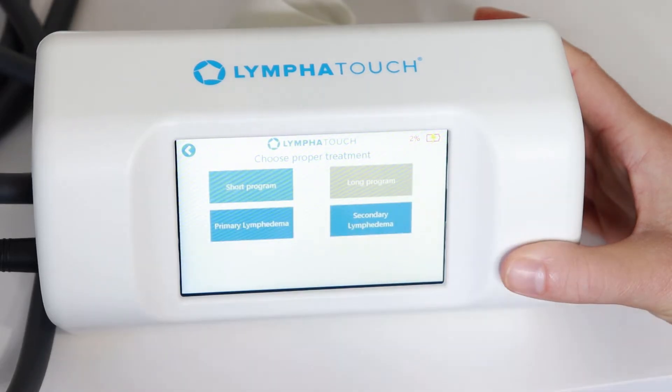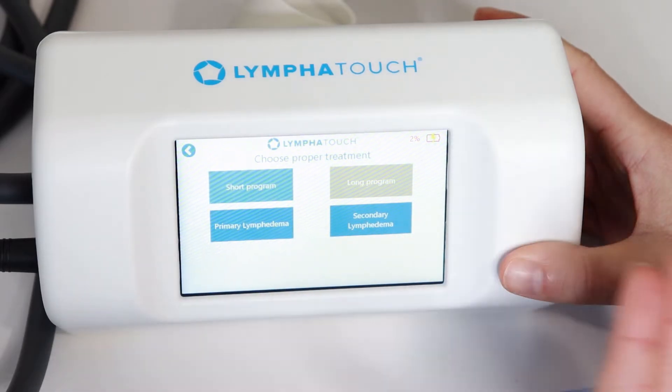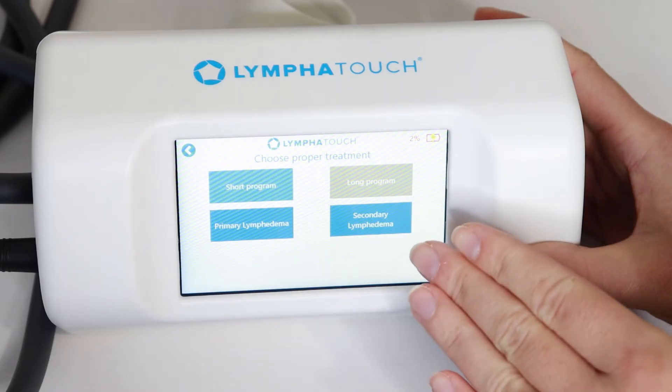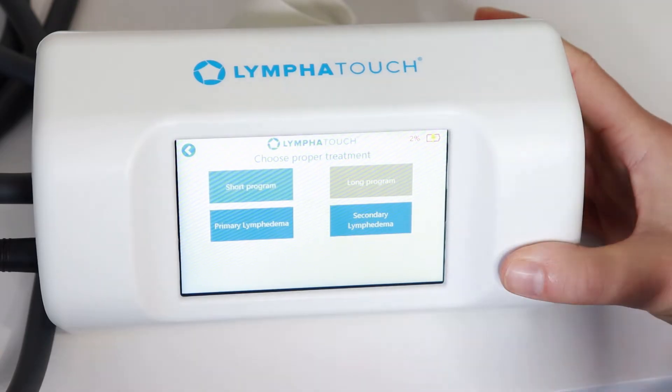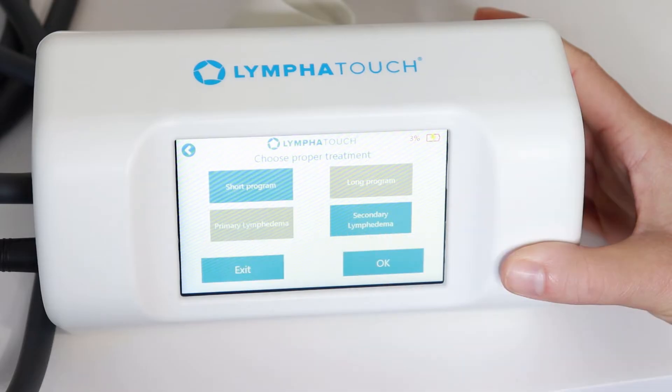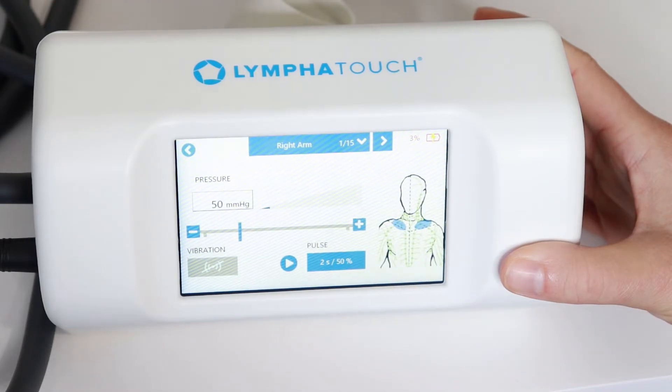When we click on a program, it then breaks it down into either primary or secondary lymphedema, which is really important. Secondary lymphedema is typically when lymph nodes are removed or there's some sort of trauma to the lymphatics — such as lymph node removal for cancer. Primary lymphedema is more of a genetic condition, something someone is born with. Secondary lymphedema involves that localized compromised area, so we do lymphatic drainage differently than with primary, which can be a generalized full-body issue. Selecting secondary and hitting okay brings up the routine.